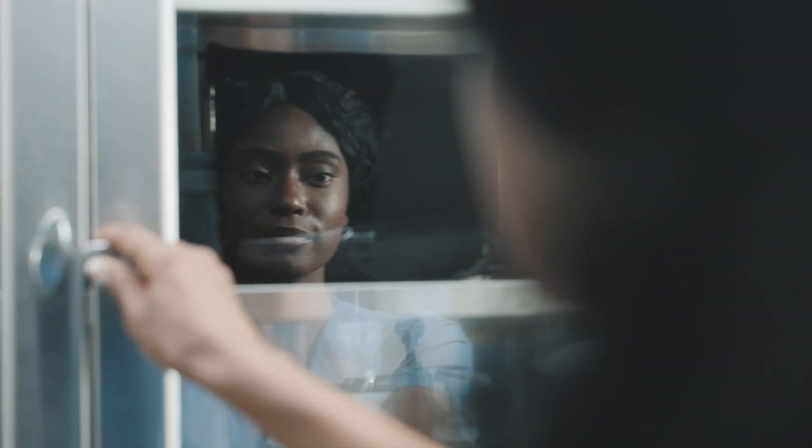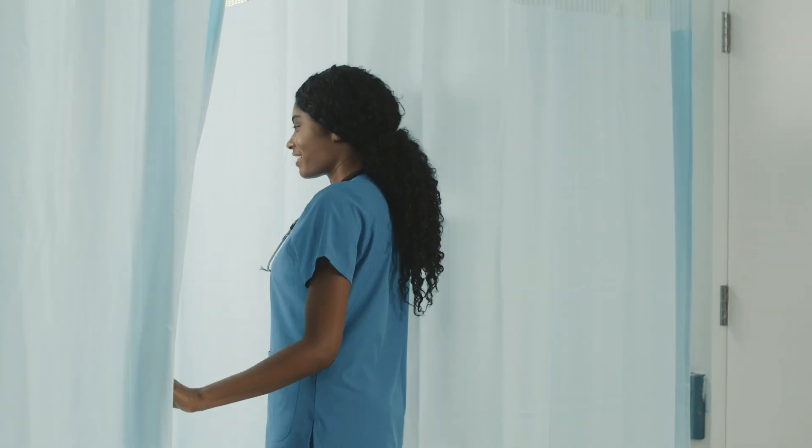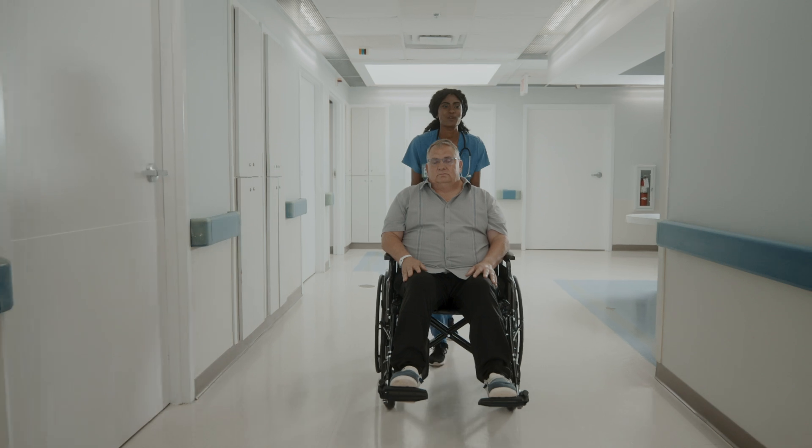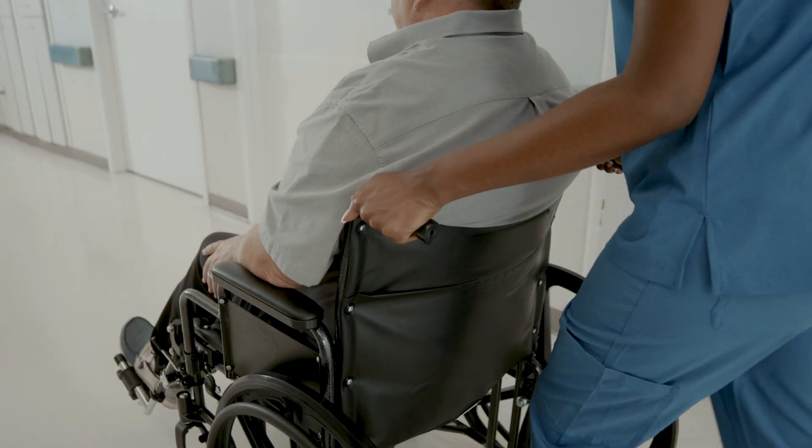In your work routine, you're experiencing demanding jobs and fulfill countless tasks every day. Getting accurate weight of patients shouldn't be another burden.